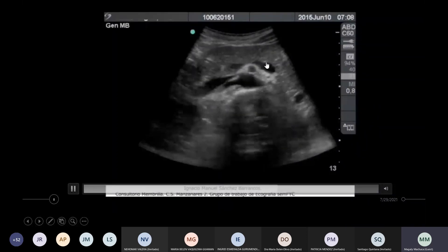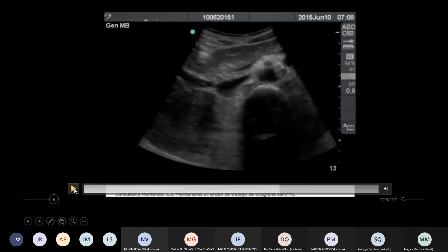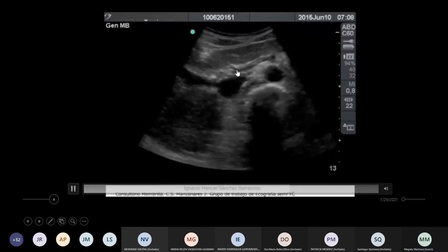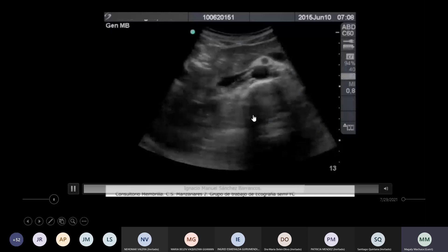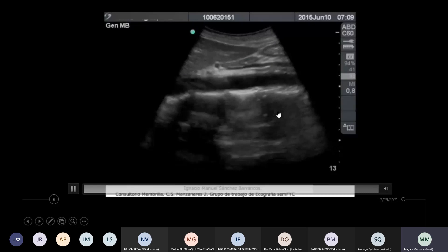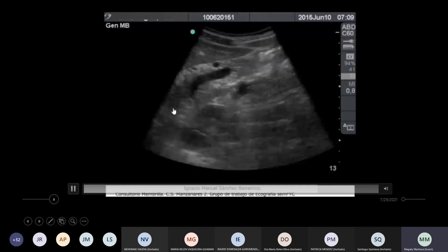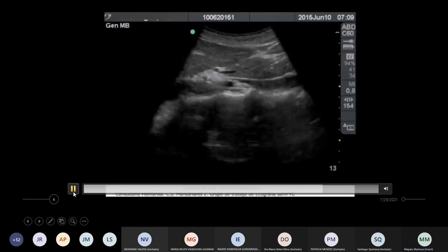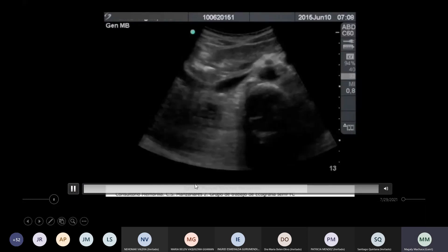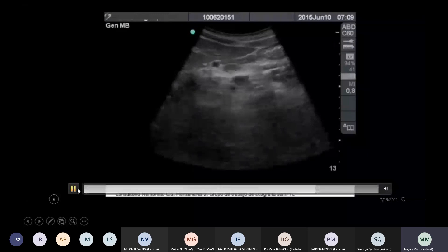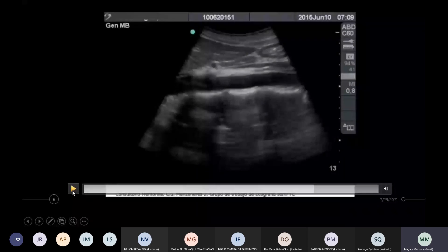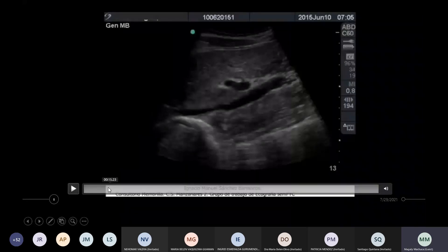Esta es la vena esplénica. Miren la vena esplénica para formar luego la vena porta. Estamos en la línea media. Esto es columna vertebral hacia la parte posterior. Recordemos que el páncreas era retroperitoneal. Aquí estamos en sagital. Esta es la aorta y van a ver cómo va saliendo el tronco celíaco, la arteria mesentérica superior e inferior.